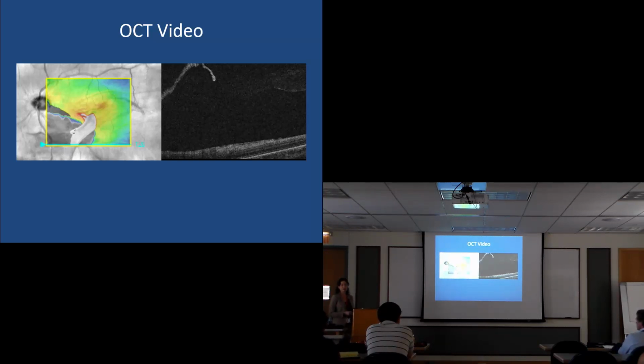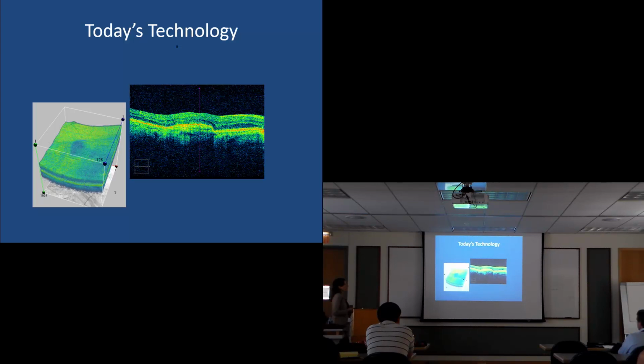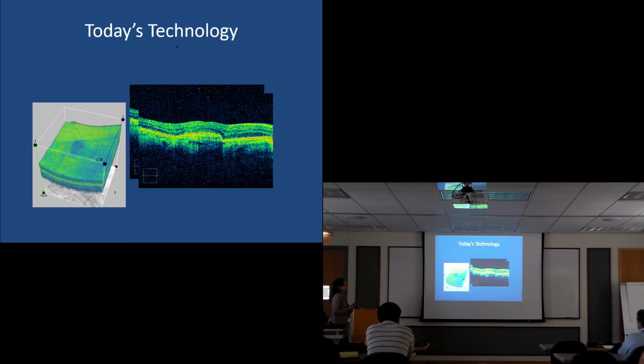They're really looking forward to it for complicated cases where they can be assured that they have all the pathology removed, but not the healthy part of the retina. So this helped and guide this case. Another way of looking at the materials, and what we're trying to encourage as specialists in medical retina, is that we have all of this information.